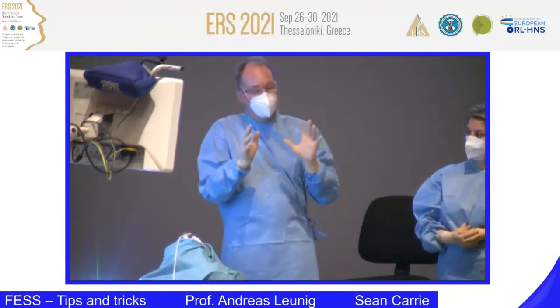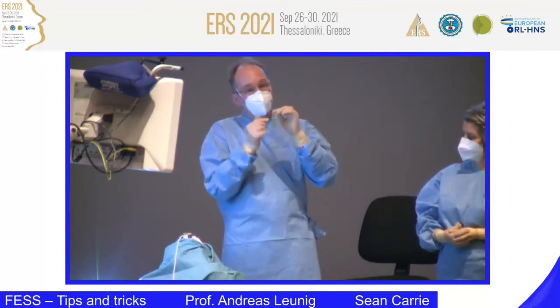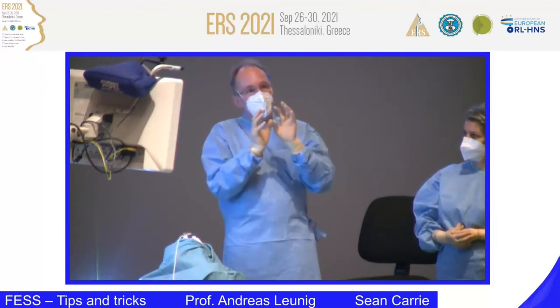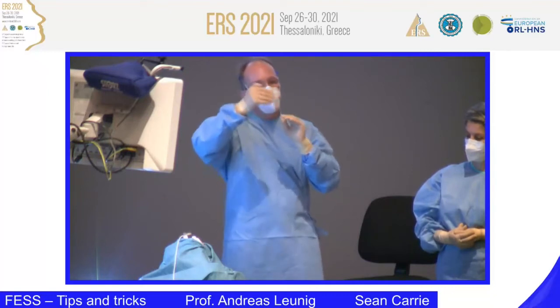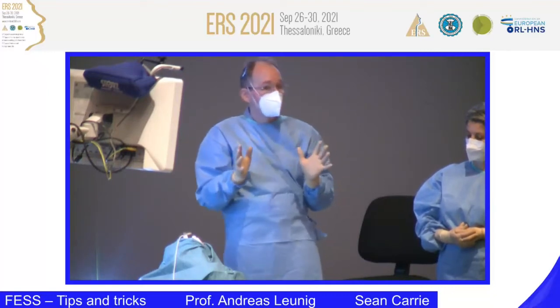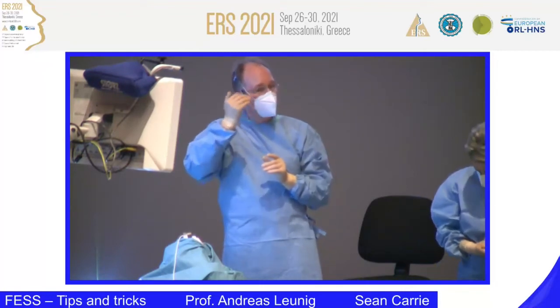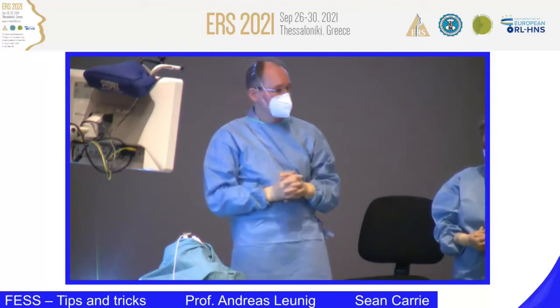There are some discussions going on. When you resect both of these structures, this is for me the most important thing, how to open the way into the frontal recess, the different cells, and further on into the frontal sinus. So it's a very good question. The agger nasi cell is very important, and you should understand where the cell is. It's the most anterior cell, and there's a conjunction to the uncinate process.